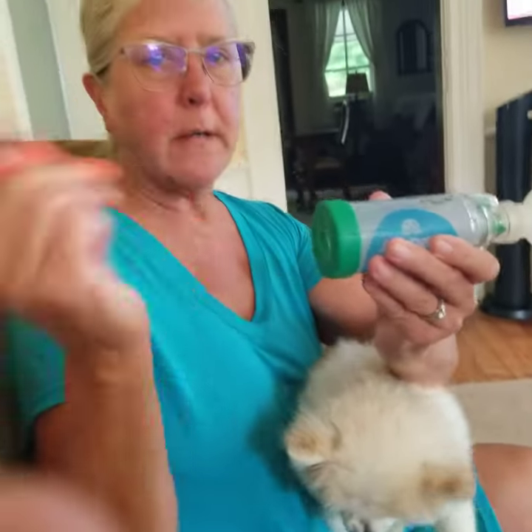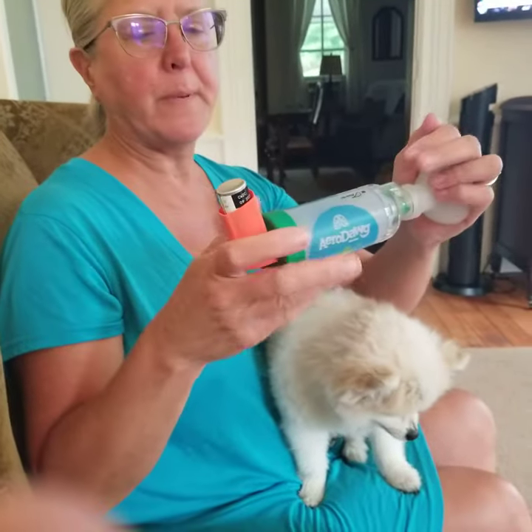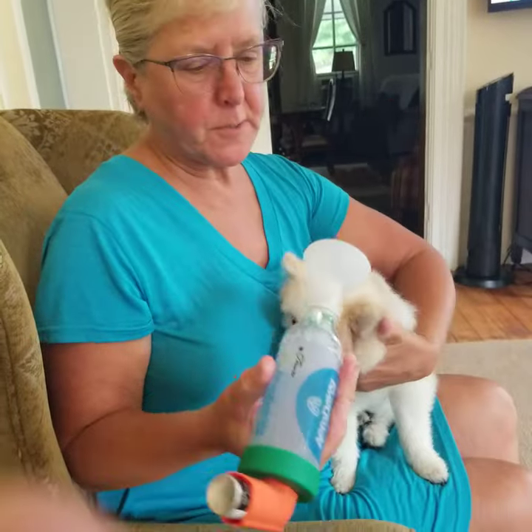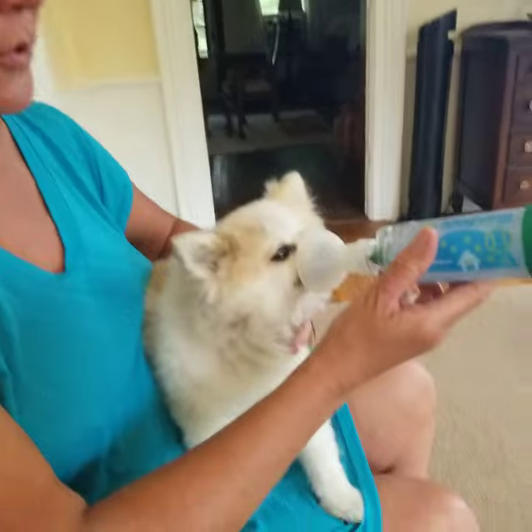I take the inhaler out, I shake it, I put it back in. I cover the mouthpiece and I squirt it in — you'll see the fog. This is placed right over her snout.